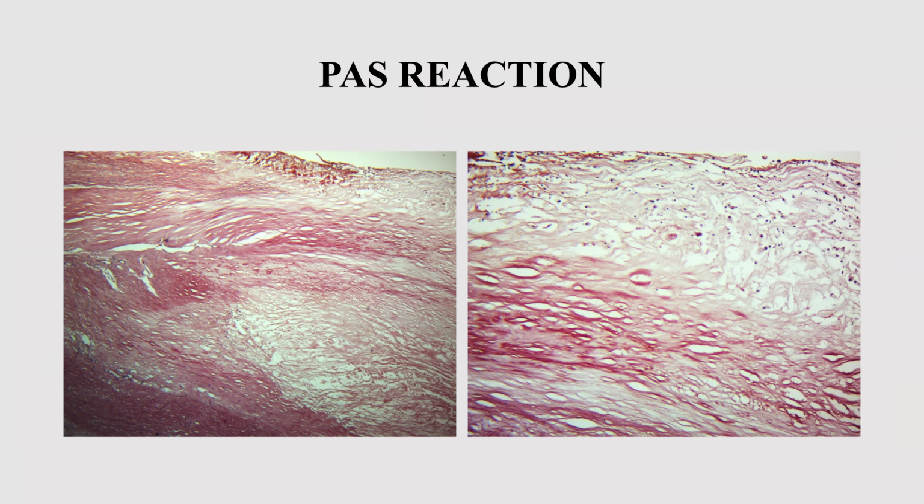It's difficult to evaluate, it's some subjective color, a sign of carbohydrate formation in this tissue, and there are some pathological reasons.